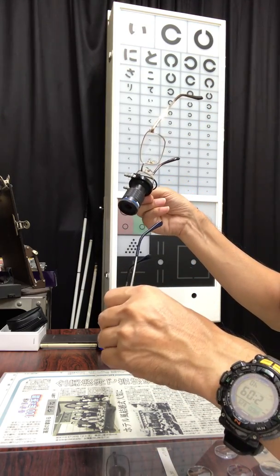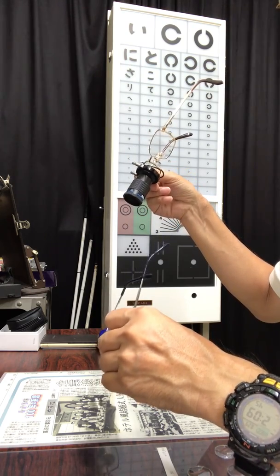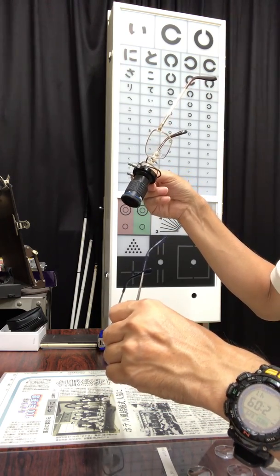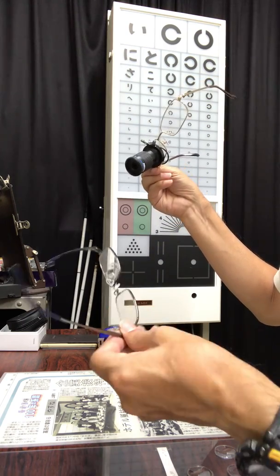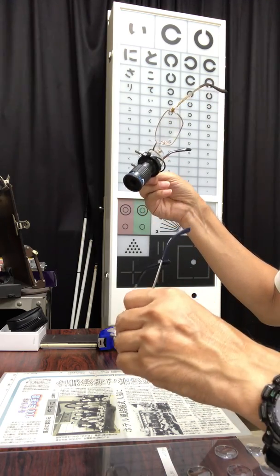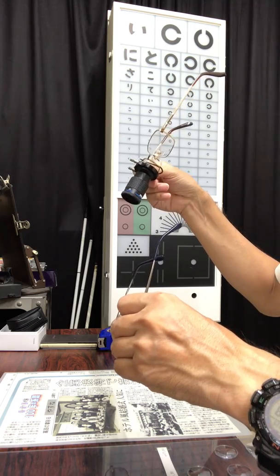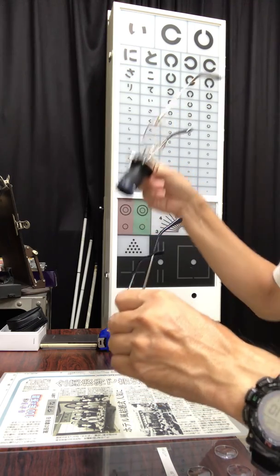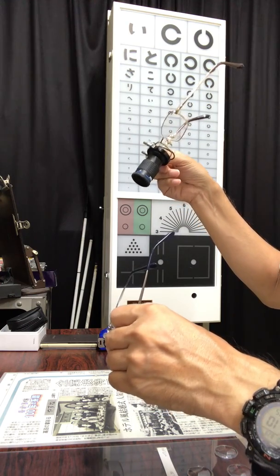The diopters of these two eyeglasses are the same. 16 diopters. As a matter of fact, this is 17 diopters, but almost the same. So, you can see the same image from these gadgets, but different working distances.